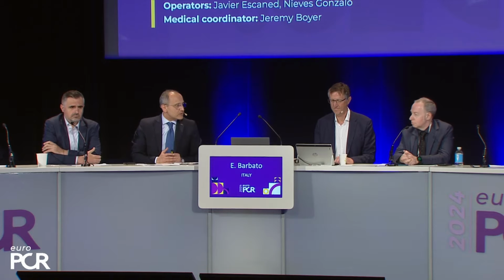Now, let's move a step forward and let's start reasoning and brainstorming on the procedural setting here. Now we are in the treatment mode, and I would like to pitch the colleagues here. Use your iPhone to let us know what would be your guiding catheter size. That's what I want to hear from you. Transradial, transfemoral, these kinds of information. We'll try to collect them in the chat box. And next, what is your preferred plaque modification tools and techniques? Because I suppose there is a lot of calcium there.